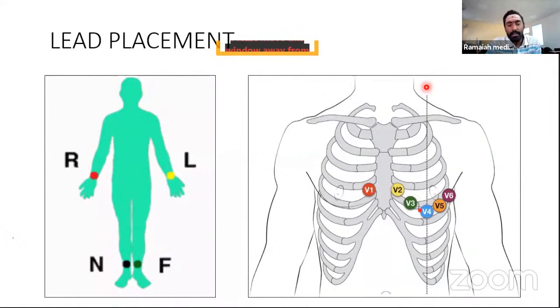And coming to the precordial leads, very, very common: you go to any ward and you ask the sister to get an ECG, inevitably V1, V2 are very highly placed, somewhere in the second or third intercostal space. Very important is where we should place these leads. Reach the manubrium sterni and then count the intercostal spaces. From the manubrium sterni, the space corresponds to the second intercostal space. So you come down: first, second, third and fourth.